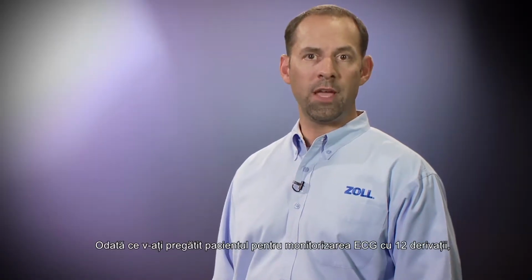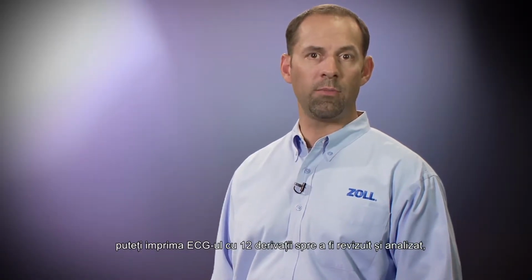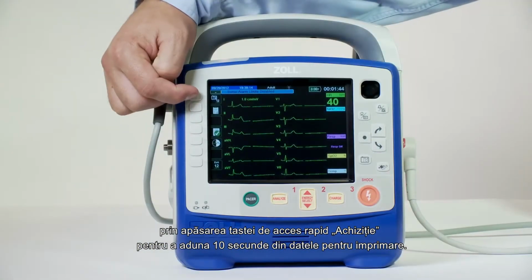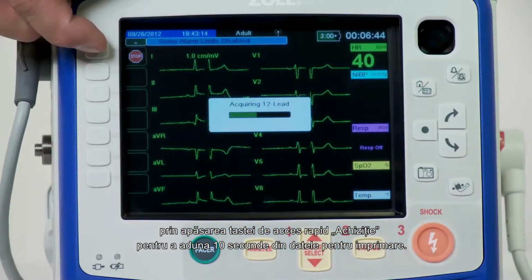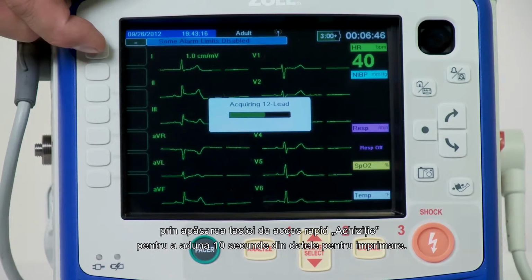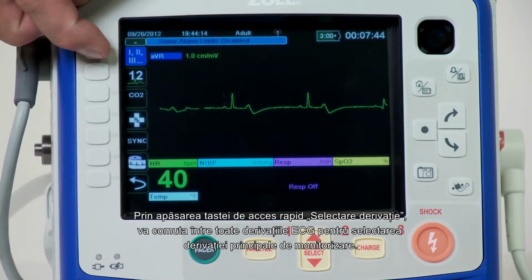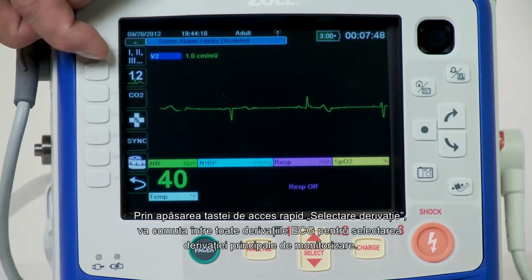Once you have prepared your patient for 12-lead ECG monitoring, you can print the 12-lead ECG for review and analysis by simply pressing the Acquire Quick Access key to collect 10 seconds of 12-lead data for print. Pressing the Lead Select Quick Access key will toggle through all available ECG leads for primary monitoring lead.